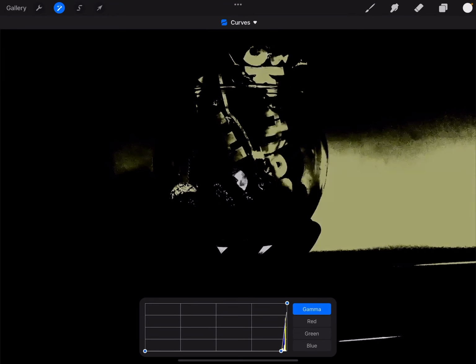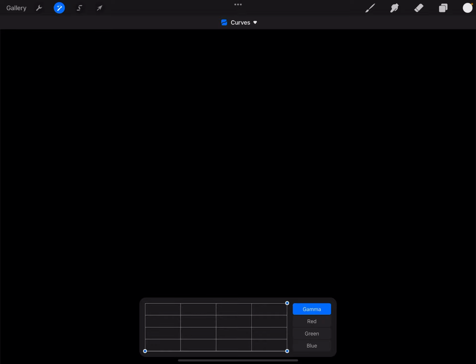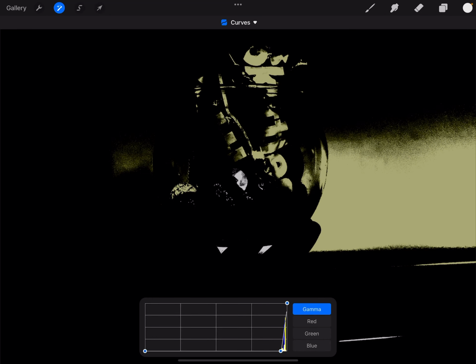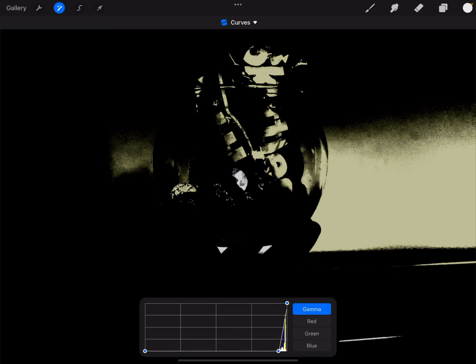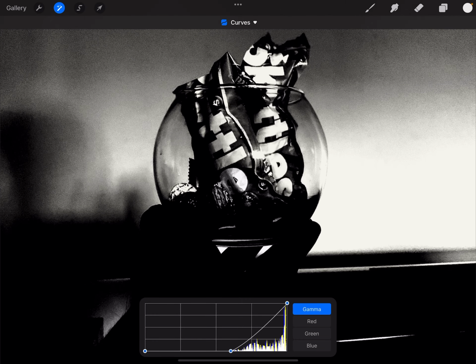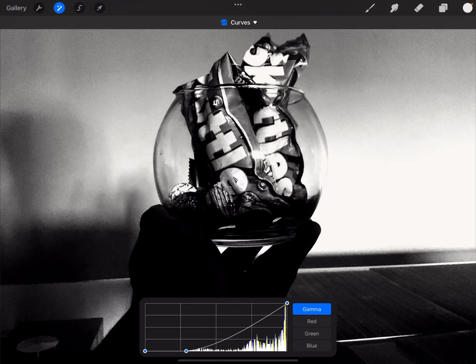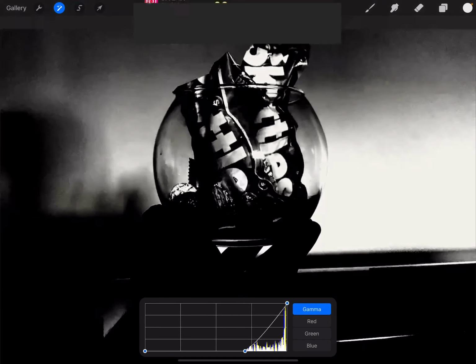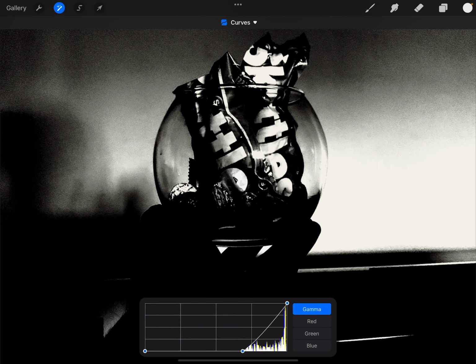Let's suppose this black image is the image receptor with no image on it. Now, as we introduce mA, the quantity of photons hitting the image receptor, you'll start to see some detail hitting the image receptor, creating an image. So as mA increases, the IR is receiving information from the X-ray tube. You'll notice the image is forming, and the more I increase the mA, the more of the image shows up. What we're not seeing is the quality of the image.